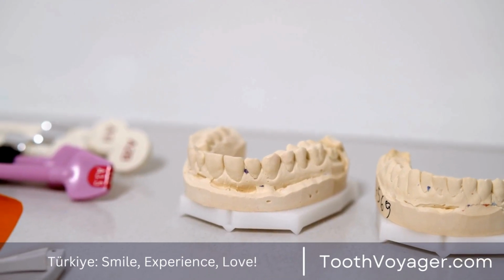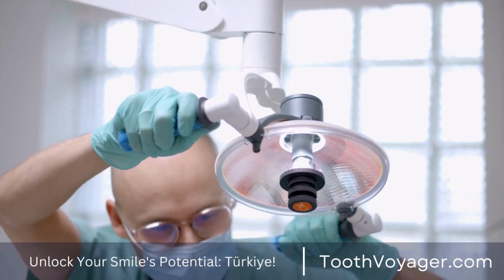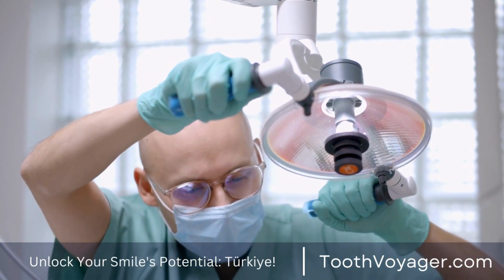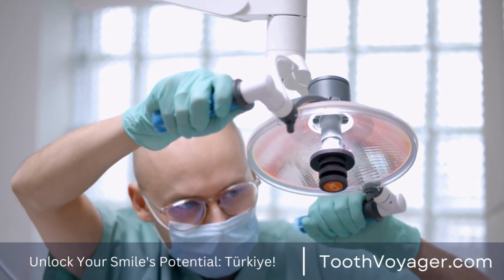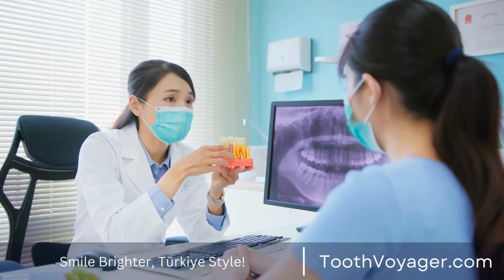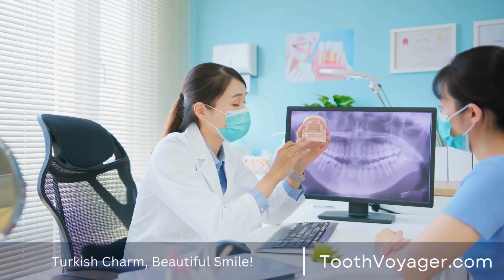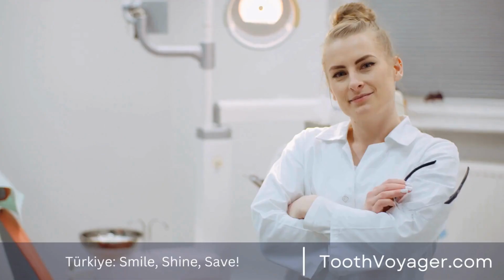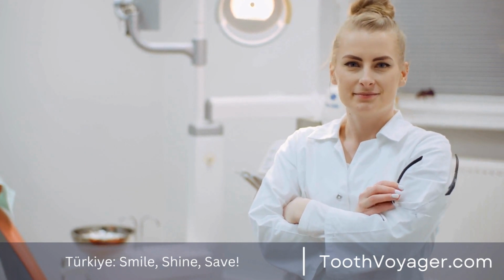In addition, 3D printing within dentistry has provided many new options for innovative treatments. Due to the capability of 3D printing to produce complicated dental structures with stunning precision, dentists now have the ability to perform procedures that were previously believed to be inaccessible. In particular, 3D printing has made it possible to make high-quality, detailed surgical guides for dental procedures, such as implants. These guides enable dentists to operate with greater precision and accuracy and result in more positive results for patients. The overall impact of the use of 3D printing in contemporary dental practices is truly groundbreaking.